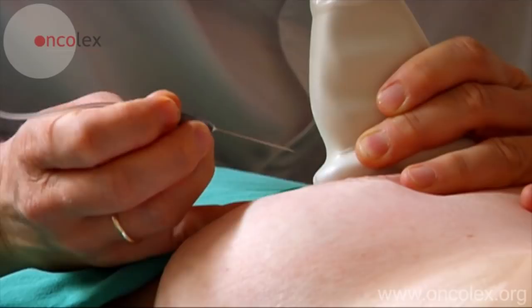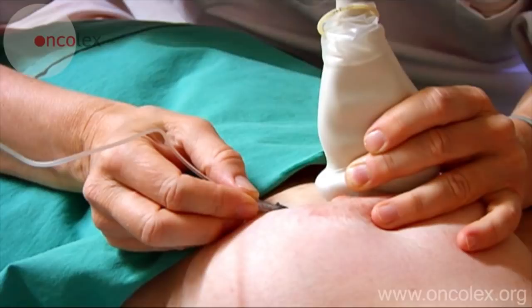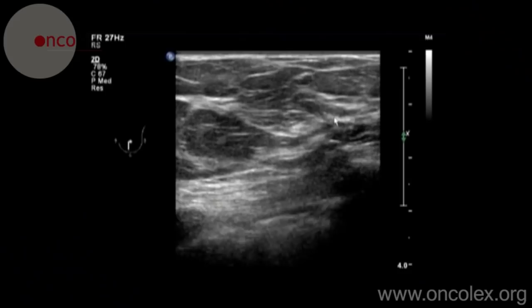The skin is punctured with a needle. The needle is attached to a syringe with a pistol grip. The syringe is aspirated and the needle is pumped back and forth in all directions.